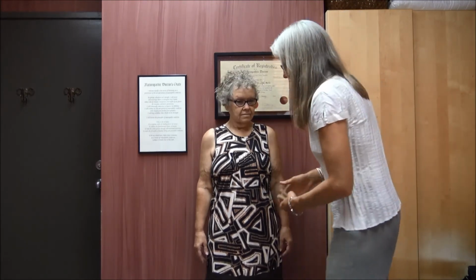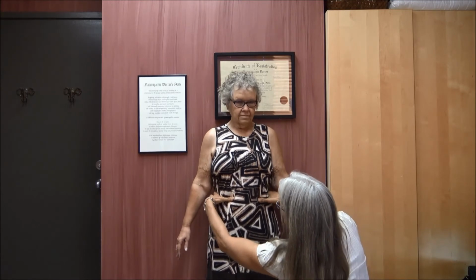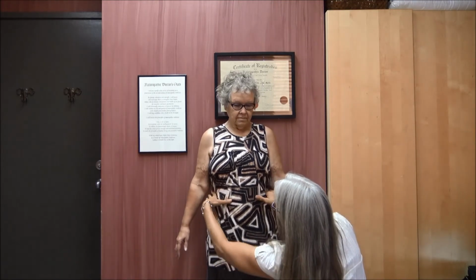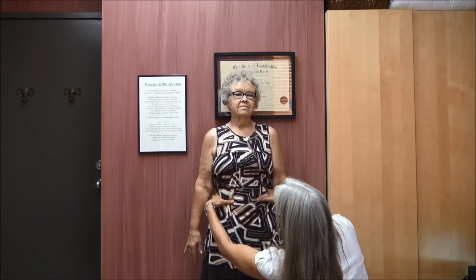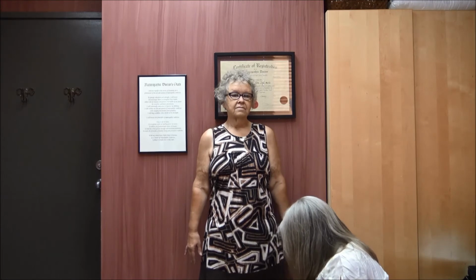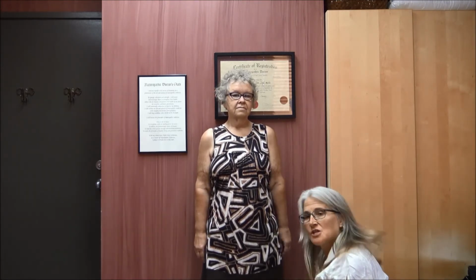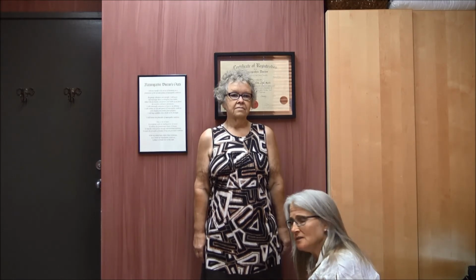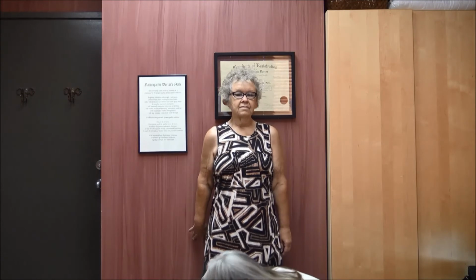So with respect to Paulette, I'm going to place my hands on her hips, and you'll probably notice when I do that, I have my hands and then I bring my thumbs around to the front, and you can see how her right hip is lower. So what I'm going to demonstrate is determining what height of a lift we would use. I'm actually going to put in the correct one initially. So let's put this underneath and drop your foot down.